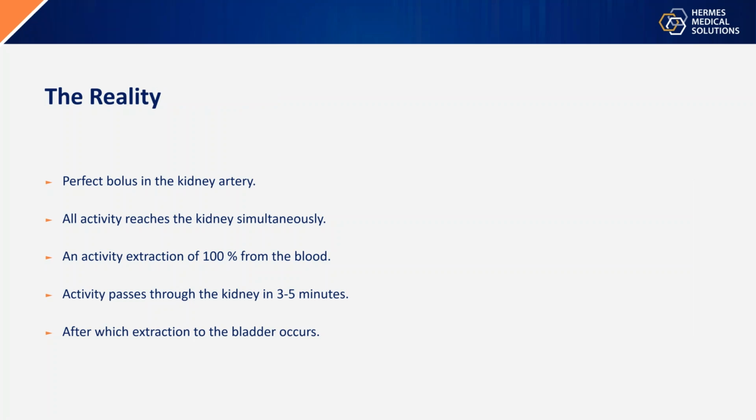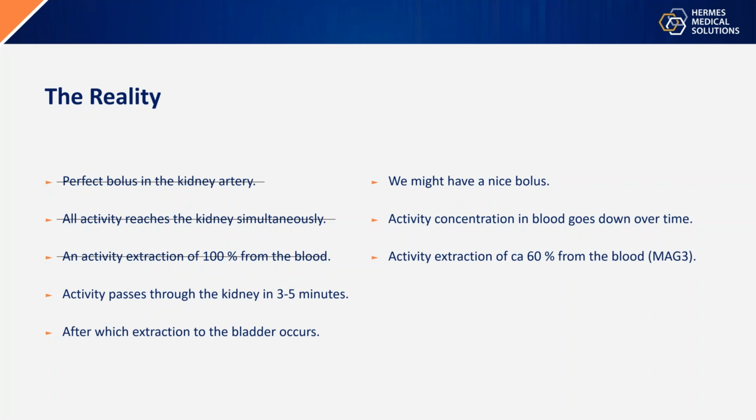However, reality. In reality, we might have a nice bolus, but it will never be perfect. Activity concentration in blood goes down over time instead of instantly reducing to zero. For MAG3, we have an extraction rate of perhaps 60% per pass.